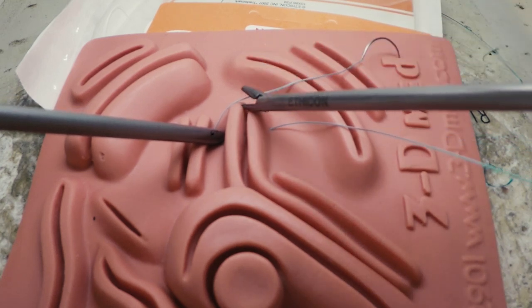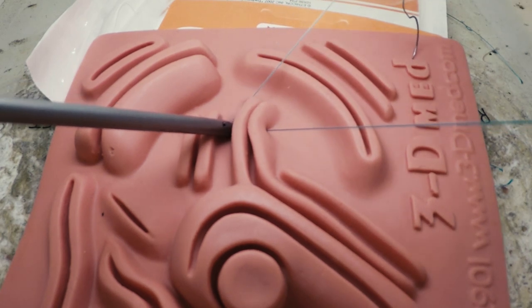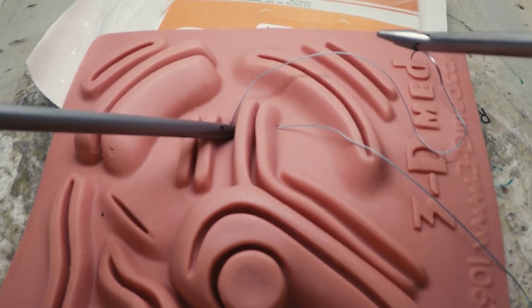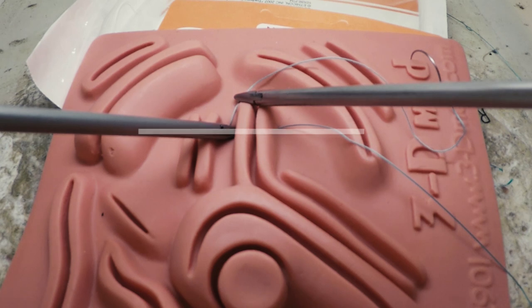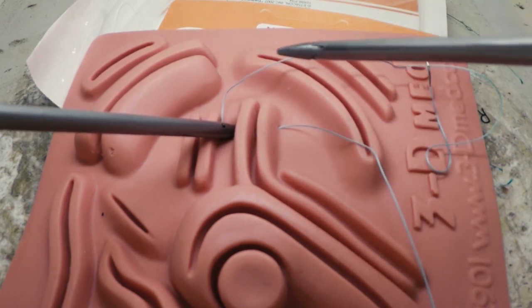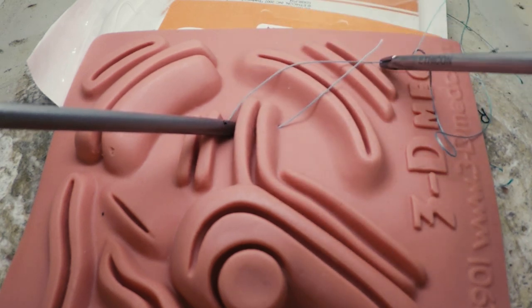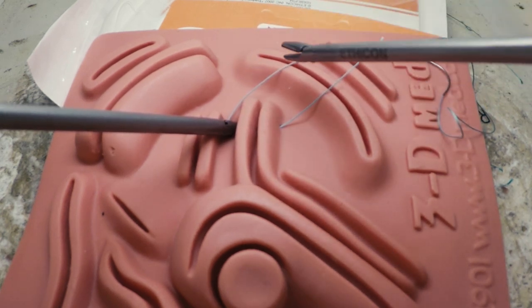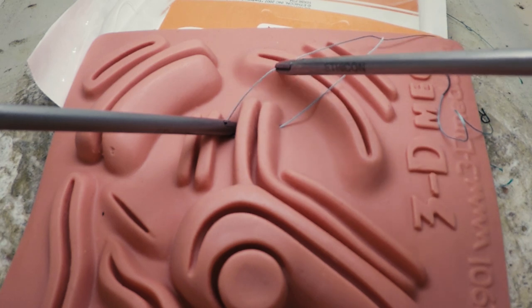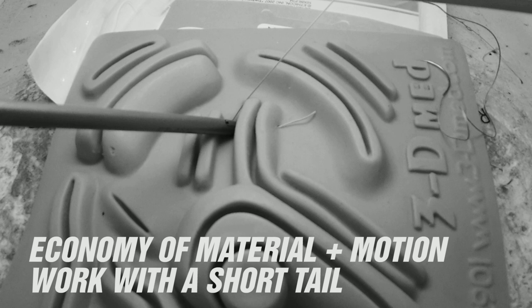Gather the suture where you have the most room on your screen, either above or below the equator. This equator later determines the most efficient way to throw your knots. Keeping a short tail allows for economy of motion and material.